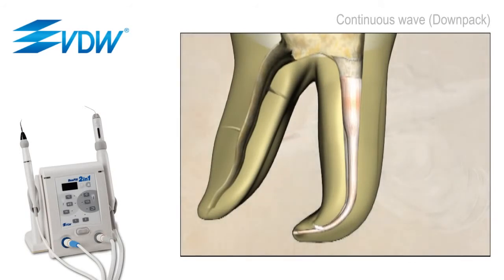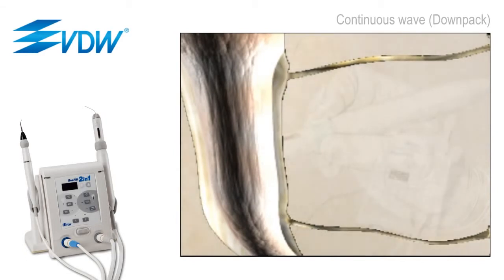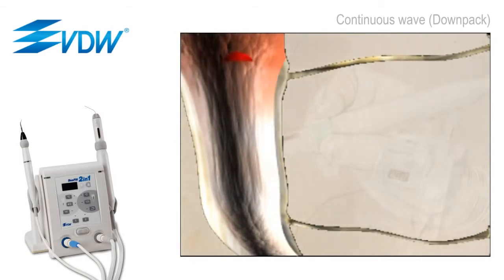In a continuous wave downpack technique, the heat carrier is inserted into the gutta-percha mass. Color changes indicate where the gutta-percha is changing temperature and being thermosoftened. The heat is kept on as the carrier is pressed further and further into the gutta-percha mass. As the carrier moves apically, gutta-percha is forced laterally into canal irregularities.